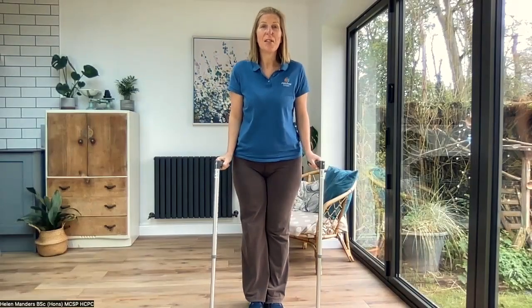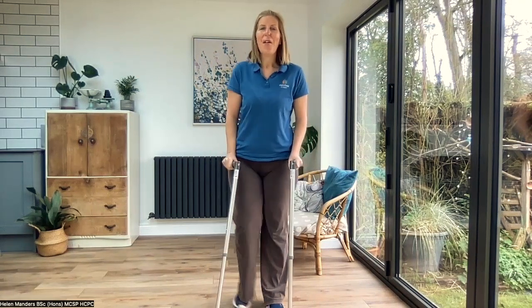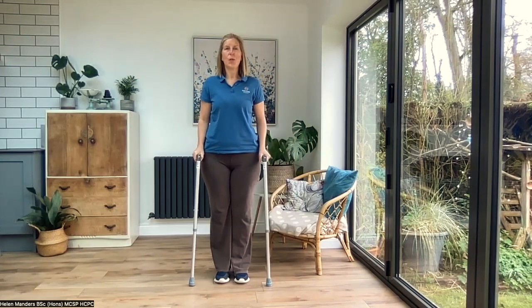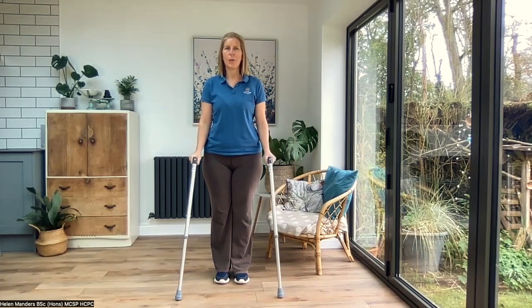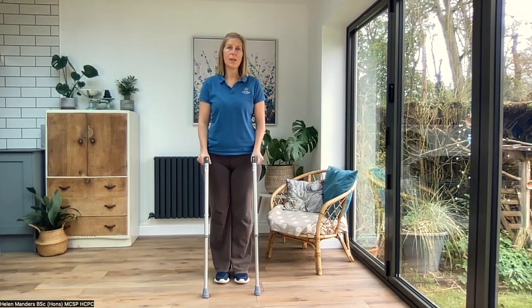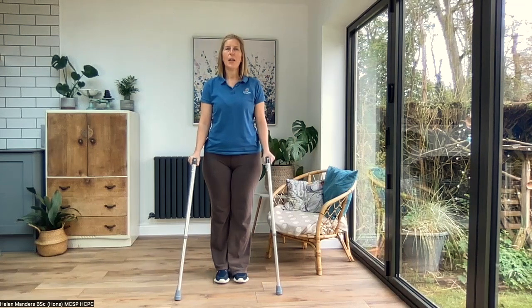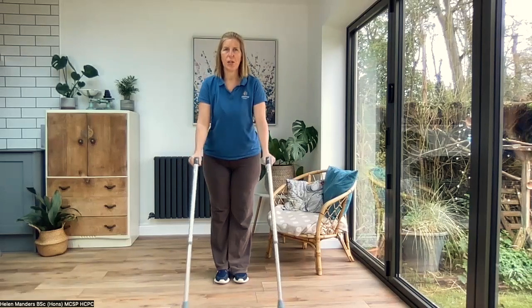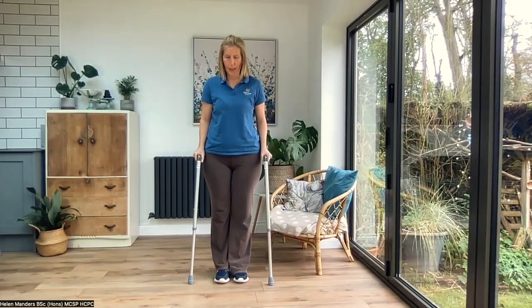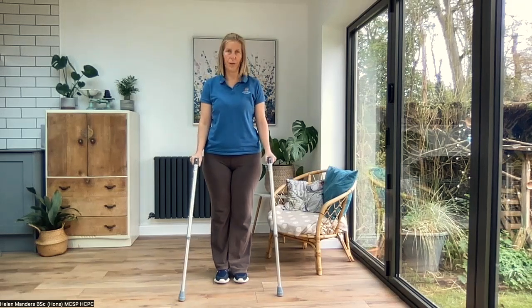So using your sticks, there's a couple of ways that we can do this. First things first is moving your sticks forwards. When we're moving your sticks forwards, we want to make sure they're out to the side. We don't want them in front of our feet because then when we come to step, we're going to end up kicking them. So make sure they're out to the side, and then you want to move them just the right distance forwards. Too far, and we're overstretching. Too close, you're going to take a tiny step. So just have a little play with that. It wants to be about a foot in front of you.